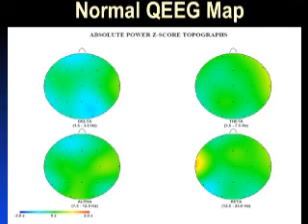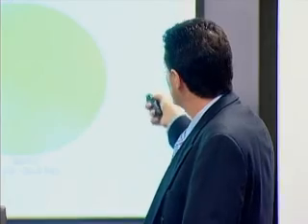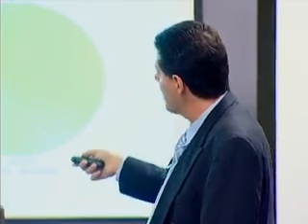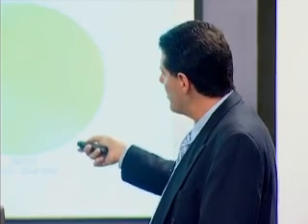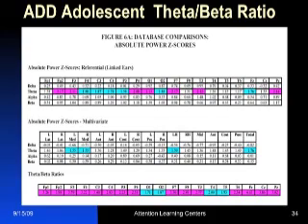This is a summary into 4 different types of brain waves. The delta, which is kind of a sleepy brain wave. The theta, which is that daydreaming brain wave we see high if you have ADHD. The alpha, which is more an inattentive brainwave and sometimes depressive, and the beta, which is the zone brainwave. And you want them all to be balanced. Now, most people with ADD are going to have an imbalance pattern. When I look at the statistics, their daydreaming to attention ratios, this was an adolescent, were 3 to 4 times as high. So that's too high.